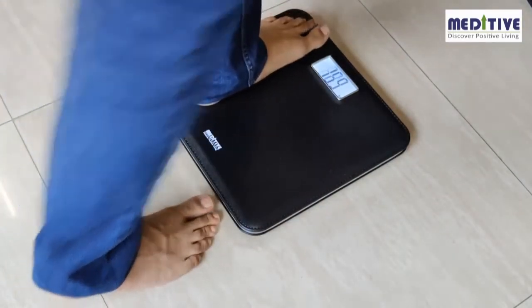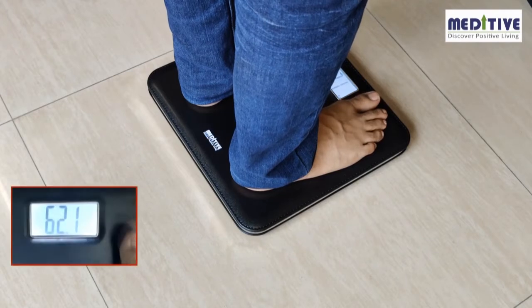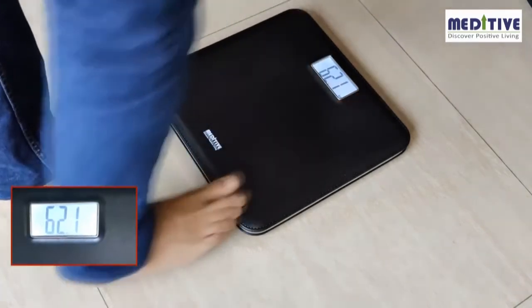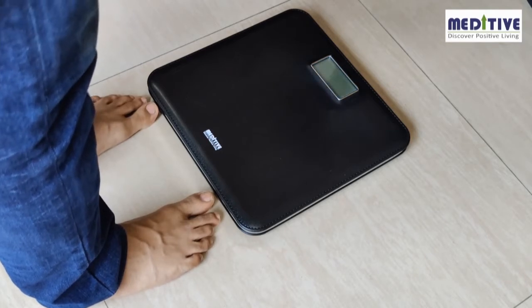You can then take the measurement a third time. The reading remains on the display for about 5 seconds, so you can step off and still see the reading on the scale. The scale also has an auto-off feature to save power.